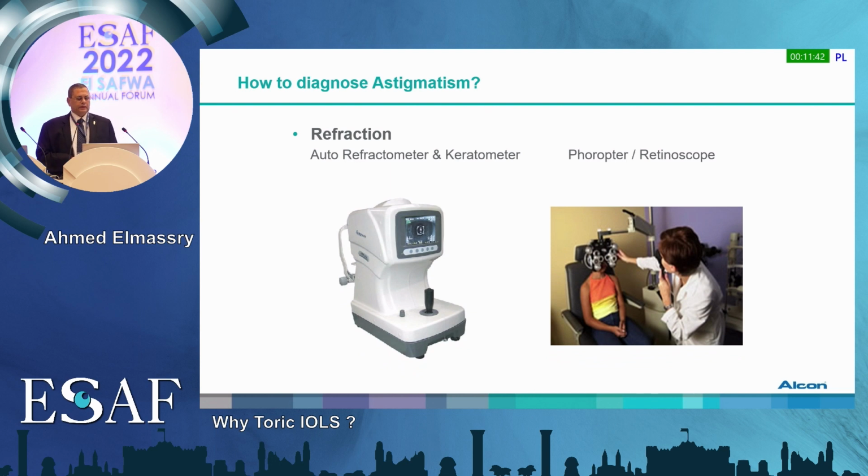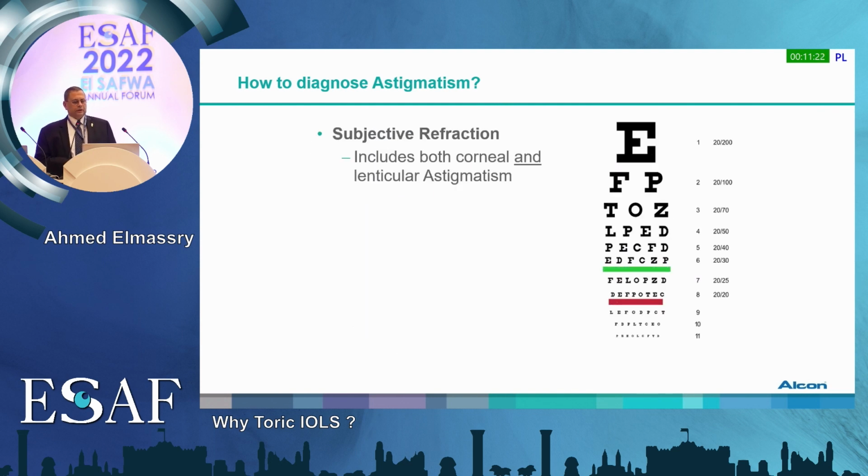Then how to diagnose it? Simply with the autorefractometer and the refraction with the retinoscopy. And of course, the refractometer with keratometer: if the mires are a little bit not regular, put in mind that this patient may have keratoconus, and you have to do topography or a further diagnosis to know whether the patient is keratoconic or not, especially in patients with aborted keratoconus in old age with cataract, which is really a dilemma, how to treat these patients to have a good refraction after the surgery.